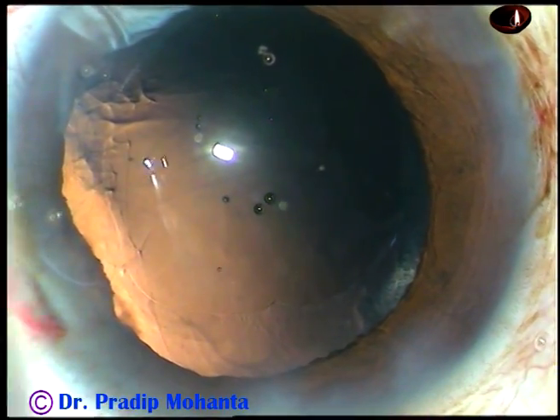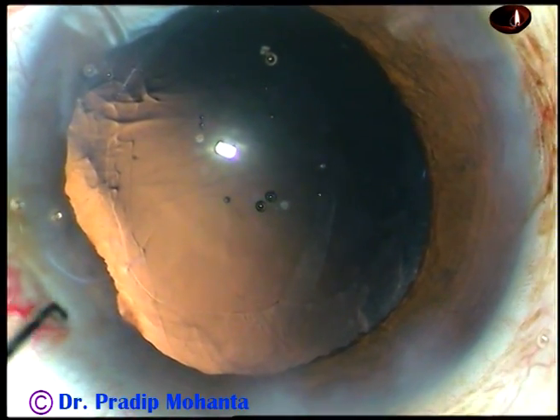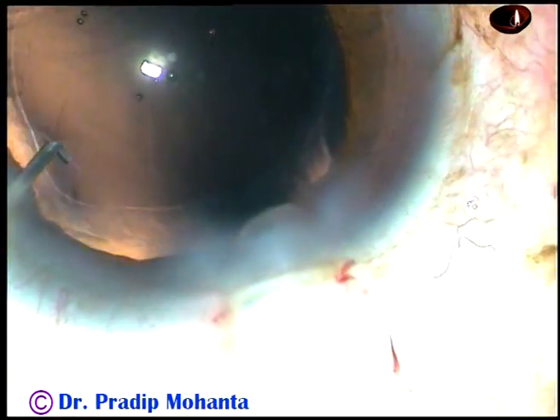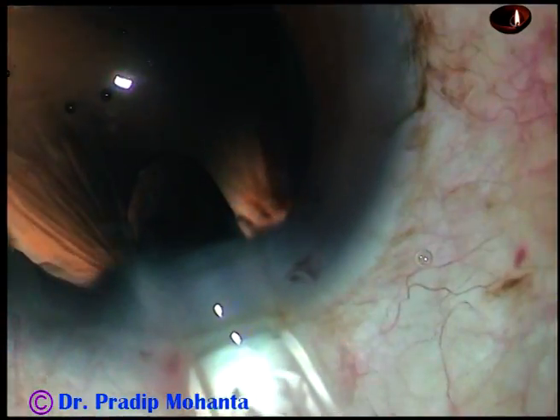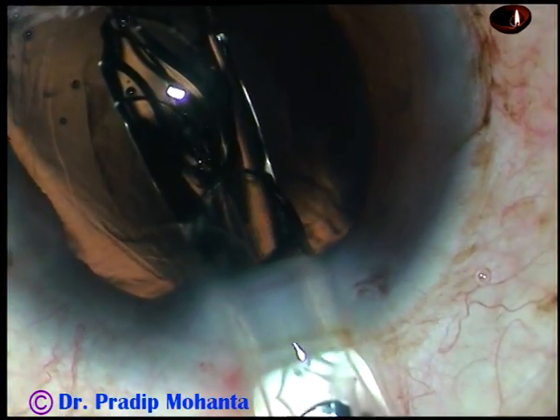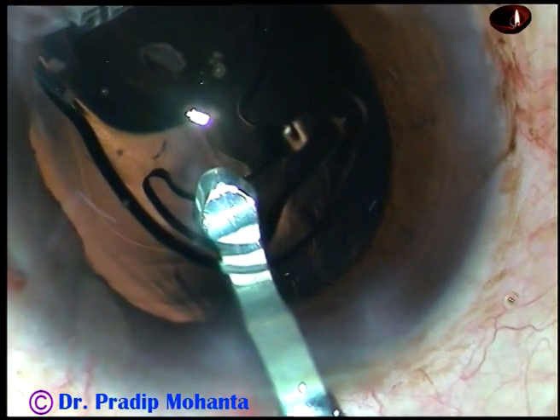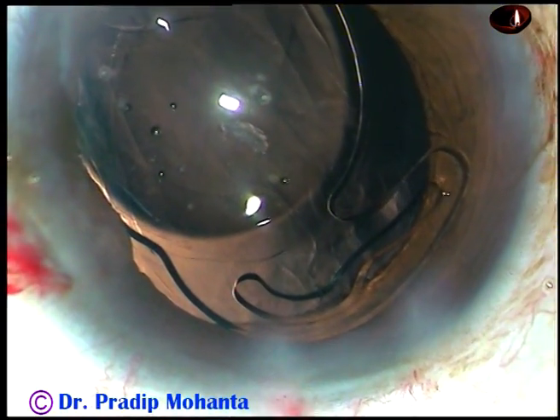Now the lens is in the cartridge. The chopper goes in and pulls the eyeball. The intraocular lens is injected into the anterior chamber — here the leading haptic goes into the anterior chamber. This is a 2.2 cartridge of Abbott Medical Optics. The leading haptic has gone into the bag, but the trailing haptic is placed over the iris.